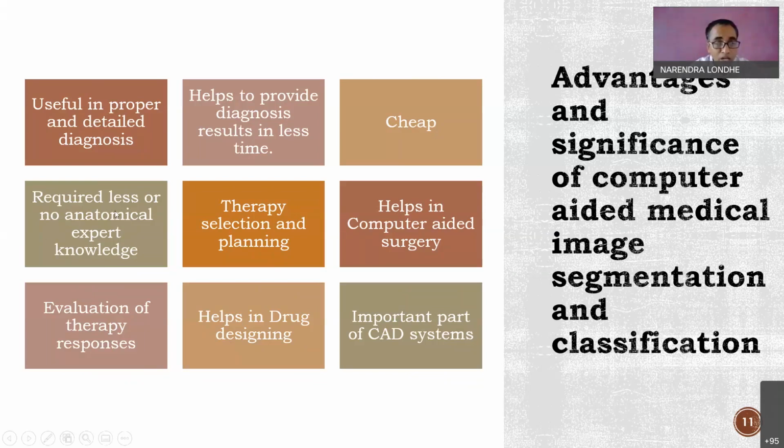It will require less or no anatomical expert knowledge, I will not say no, because whatever computer algorithm you develop will be artificial intelligence based. So intelligence will be developed, or it may be continuously updating its intelligence.